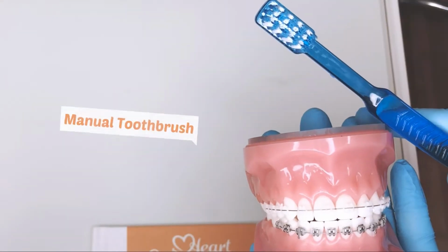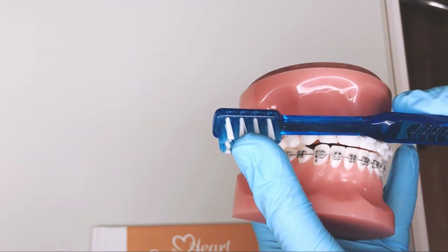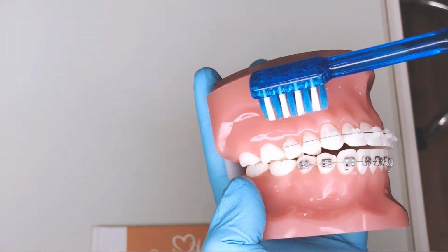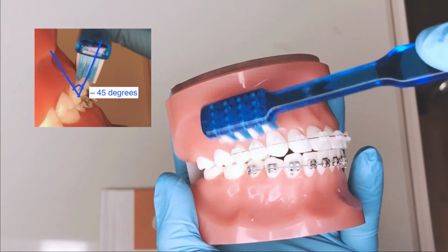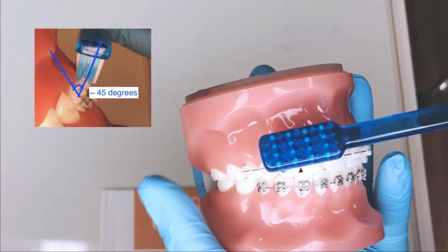Be sure to choose a manual toothbrush with soft or ultra-soft bristles. Hold it at a 45-degree angle to your teeth, so it fits right between your braces and your gums. And move it in a circular motion from one end of your mouth to the other.